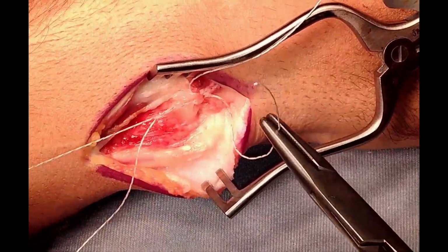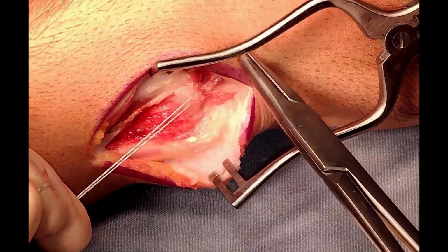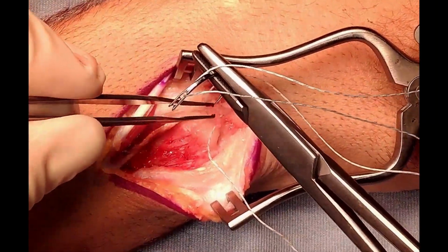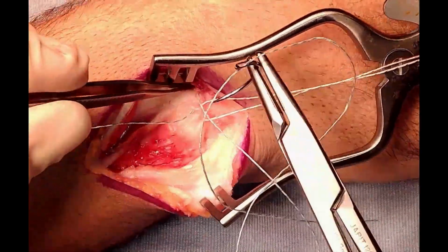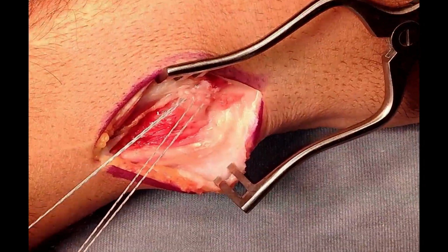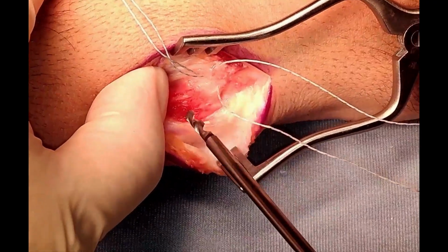So this is the first one, the dorsal ligament, part of the TFCC complex, and we'll be putting another one. Now we are putting the second fiber wire suture. We have 4 strands.